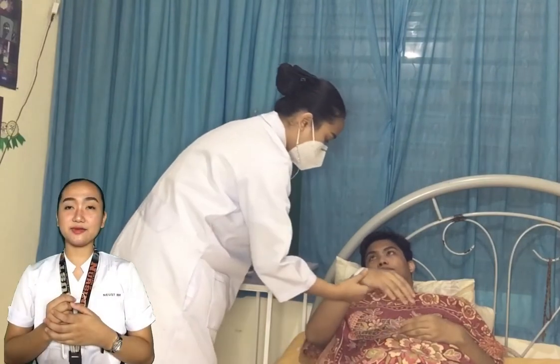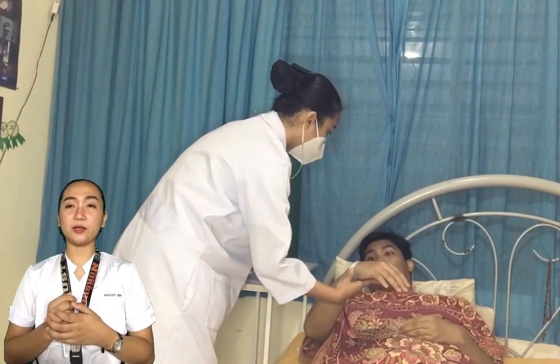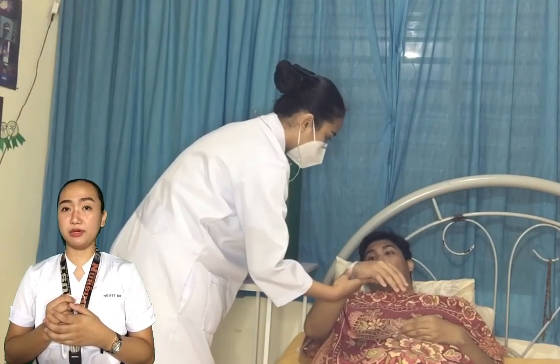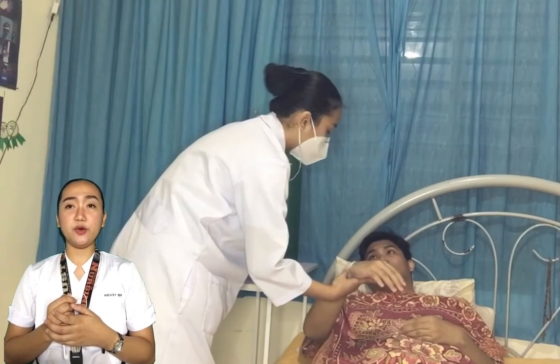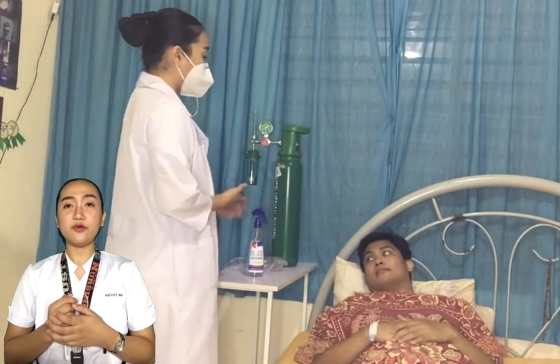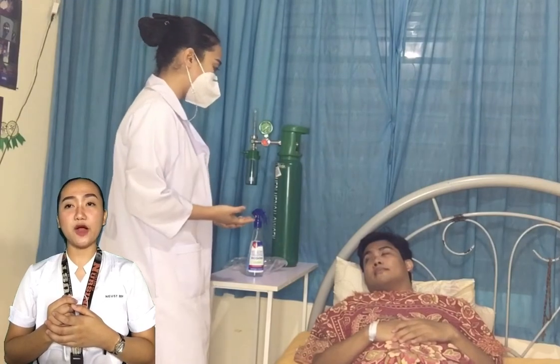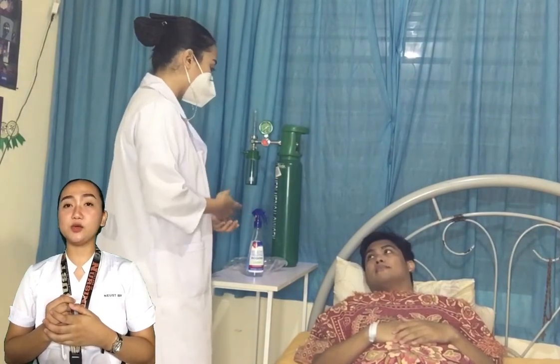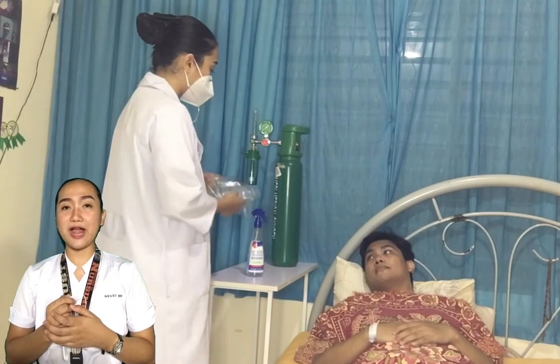Identify the patient. Close curtains around the bed and close the door to the room if possible. Explain what you are going to do and the reason for doing it to the patient. Review safety precautions necessary when oxygen is in use. Place no-smoking signs in appropriate areas.